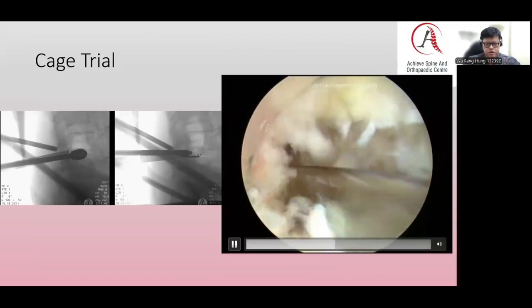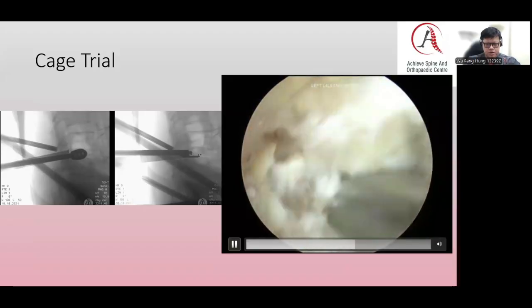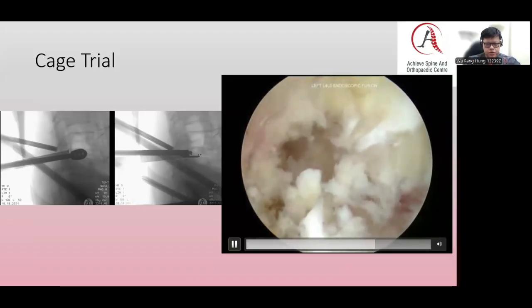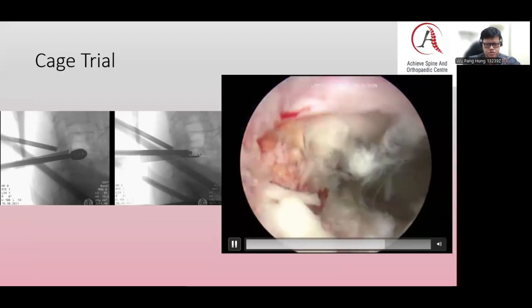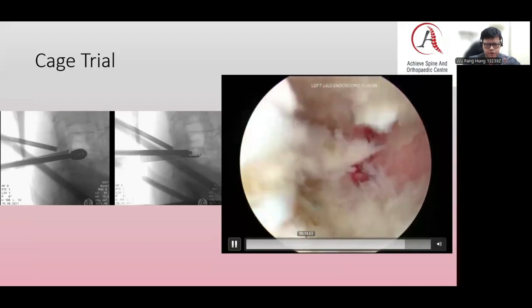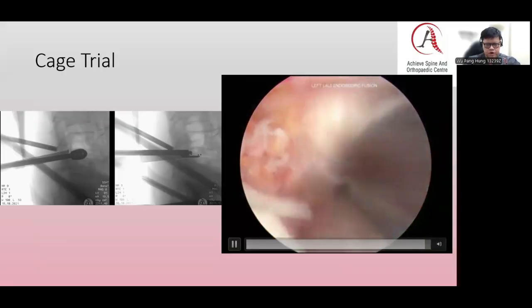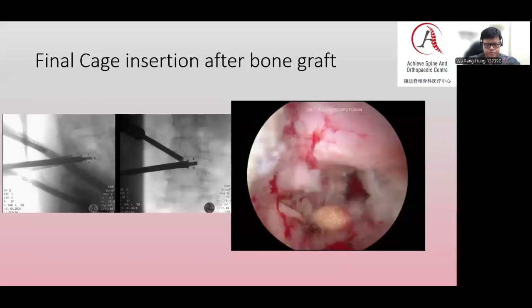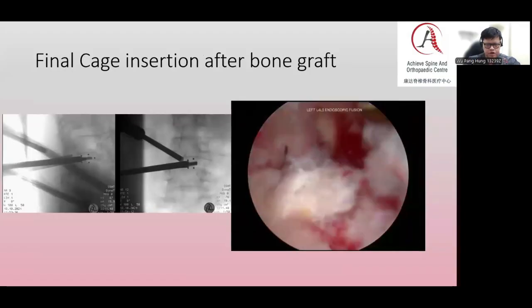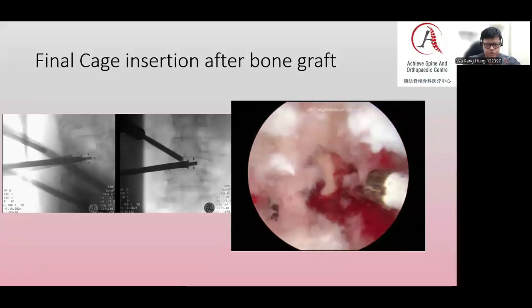I find that after we use dilators and curettes to prepare the end plate, there's still a lot of disc material remaining. So we tend to use more blunt instrumentation as well to prepare the end plate clearly before we insert the dilator, trough, bone graft, and cage. Subsequently, we will insert the bone graft and then the cage, and the cage insertion is done using a specialized retractor.